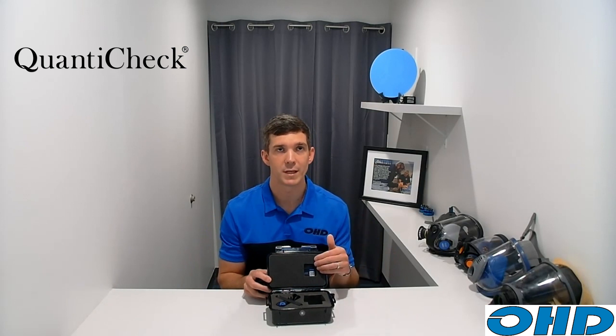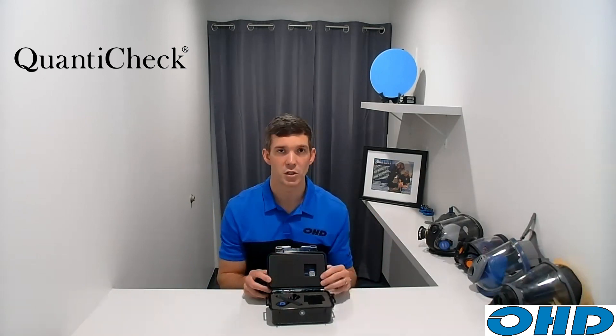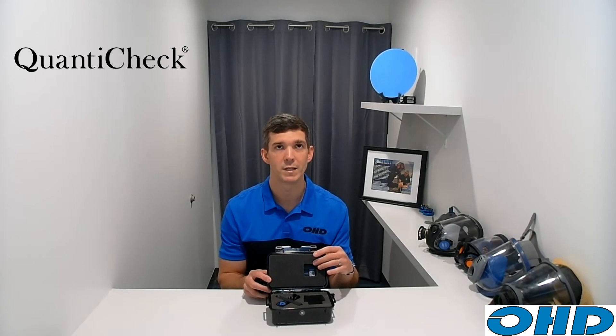Before getting into testing, let's talk about what comes in the case. When the QuantaCheck arrives, you'll notice there's no paper user manual inside — all documentation is through a QR code or our website in the top part of the lid. Scan the code and it takes you straight to the user guide, where you can download the full user manual or access a quick start guide translated into any language through Google.